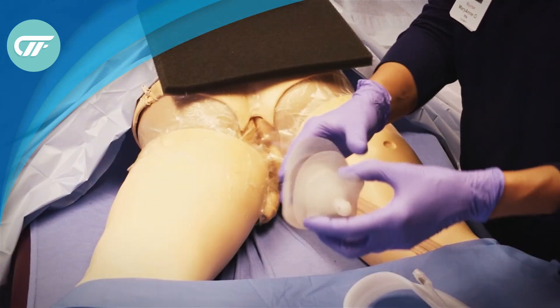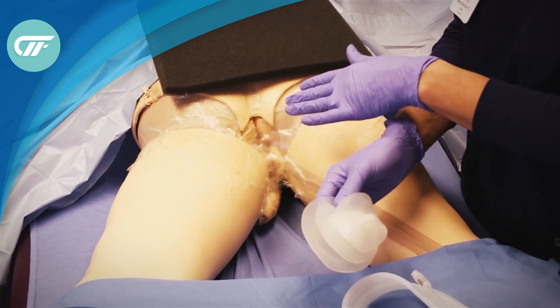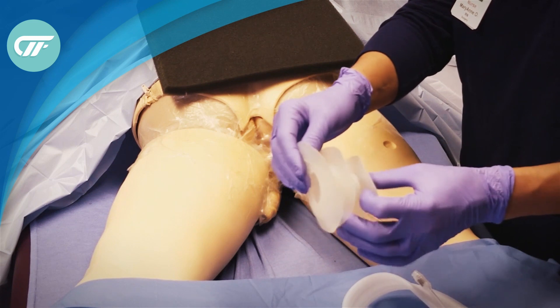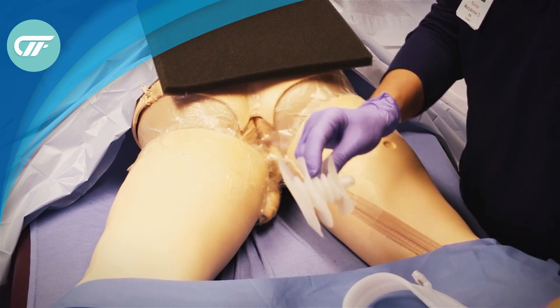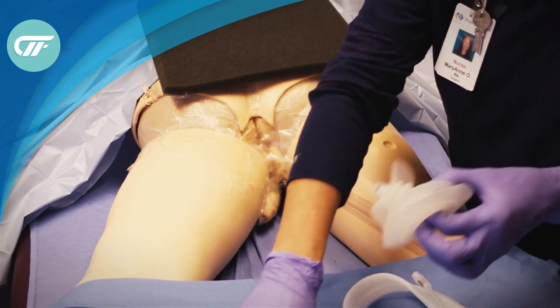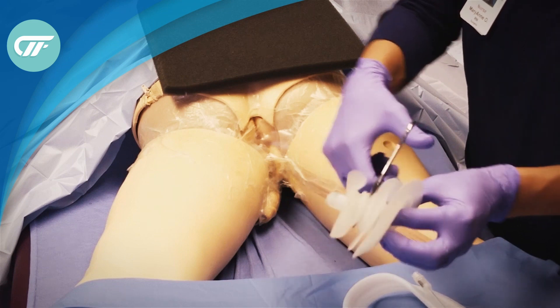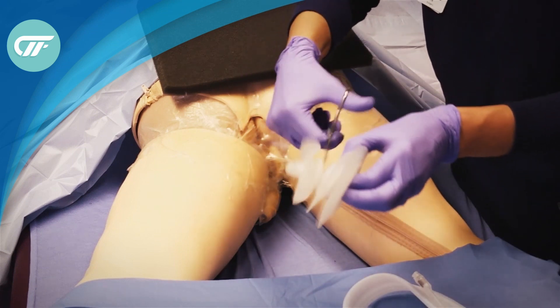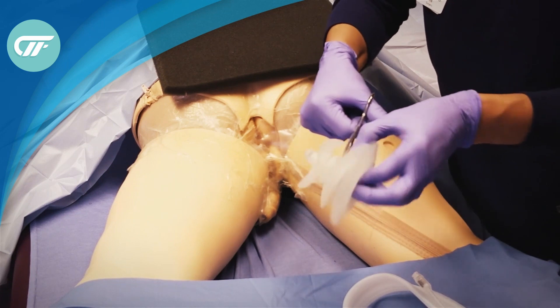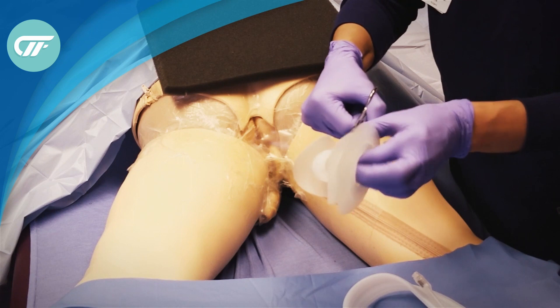Today we're going to show isolation of a fecal management system with negative pressure wound therapy using the fistula funnel device that's going to be trimmed so the fecal management system runs through the center of it. The first thing we need to do is trim the louvre of the fistula funnel. I like to trim it with the edge still intact because it helps me to get a seal around the anus.